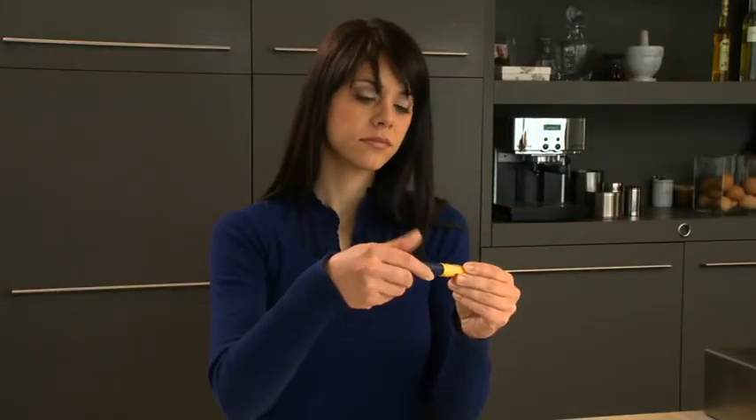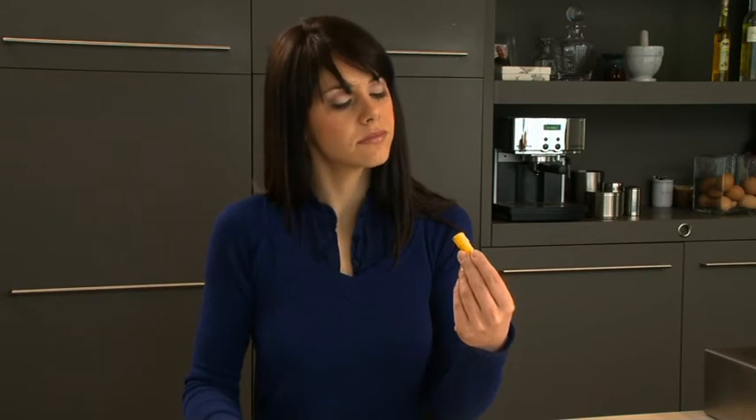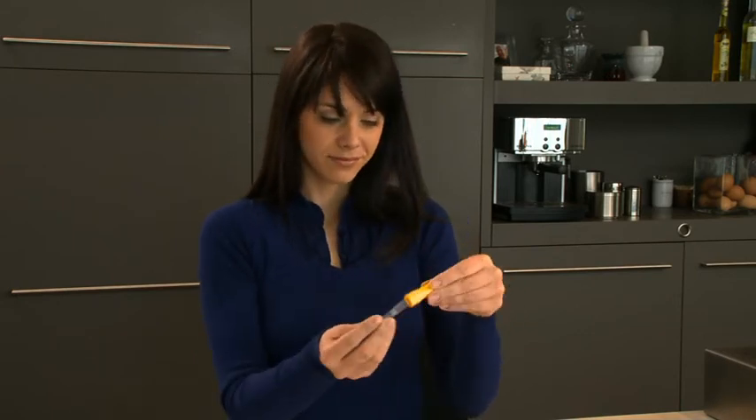If there is space, unscrew the body from the cartridge holder and check whether the cartridge has been inserted correctly.